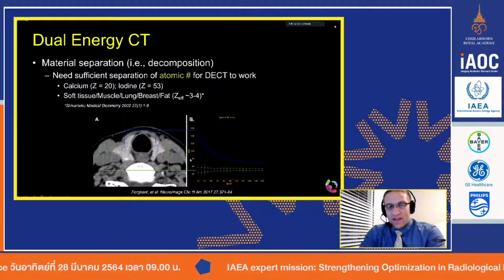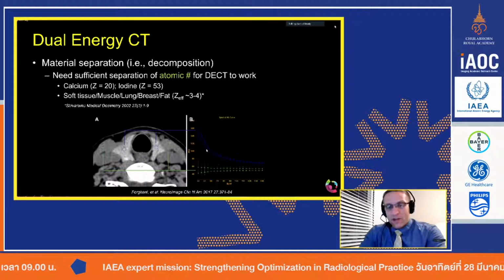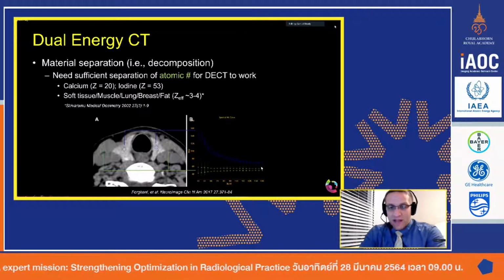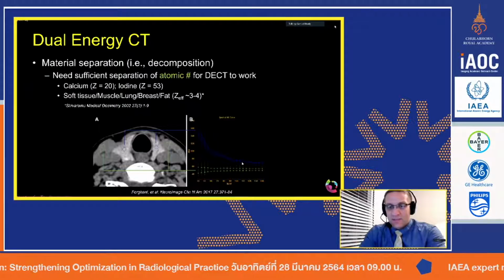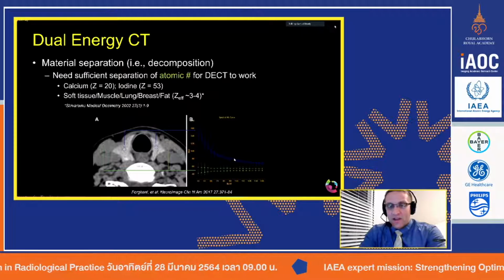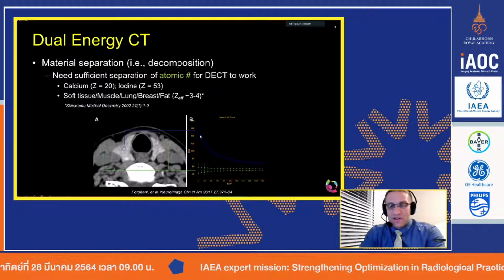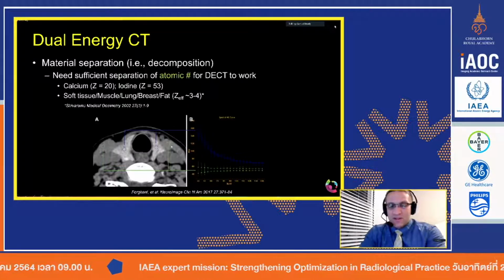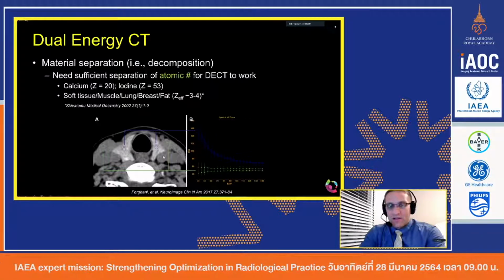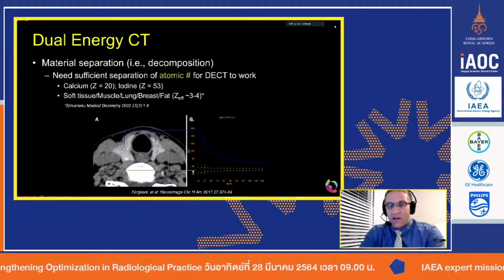And so it's going to have probably some iodine in it. And therefore, when we actually put ROIs in it and we image it at different energies, it's going to have a spectrum. It's going to be either not as bright, so more gray at the higher energies, but it's going to be much more intense or brighter, whiter at the lower energies. Now, the same could be said about the muscle, but muscle doesn't really infuse with iodine. So therefore, it's mostly going to stay the same iso gray color at all energies.